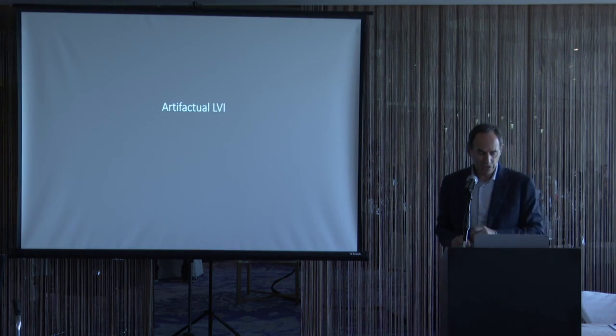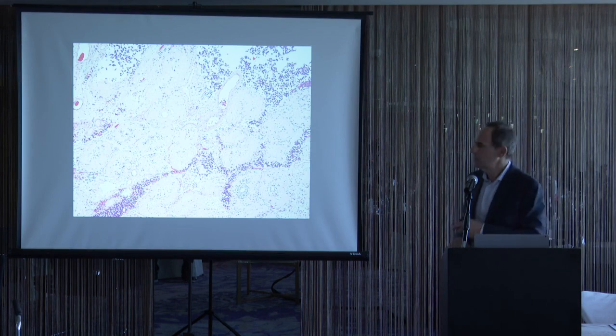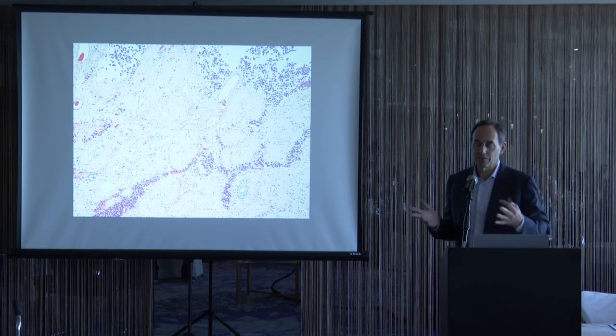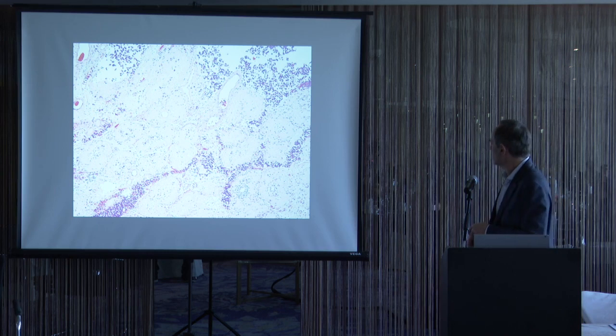So in contrast, artifactual involvement can be quite extensive. This is on the outside of the testis, and you can just see all these loosely cohesive cells everywhere, but it's kind of a pitfall, an unfortunate pitfall, that tumor cells tend to involve empty spaces. They just gravitate to empty spaces. So one can see extensive artifactual tumor in vascular spaces, but in the setting of seeing the artifactual tumor cells outside and not in vascular spaces, one would not call this true vascular invasion.